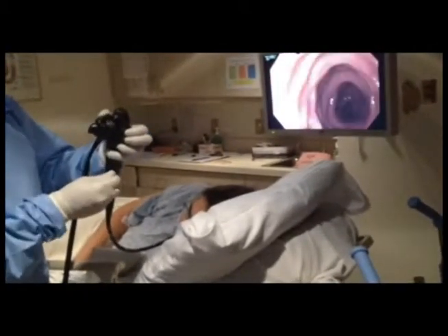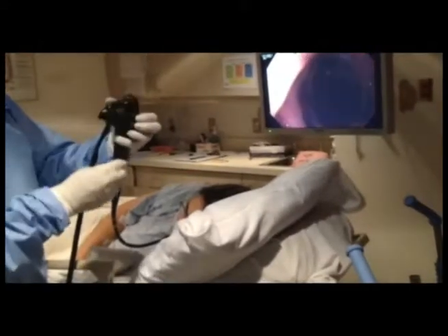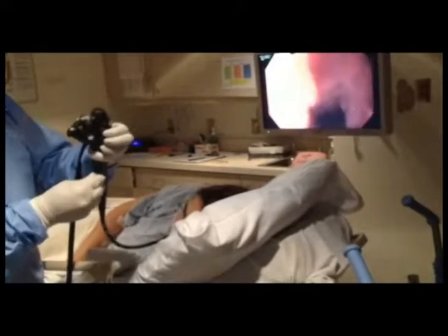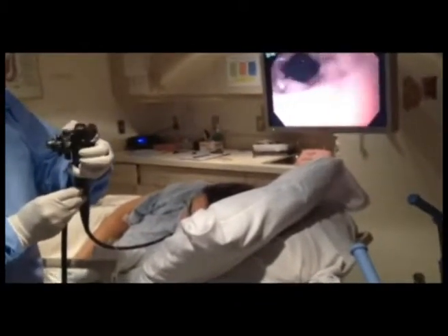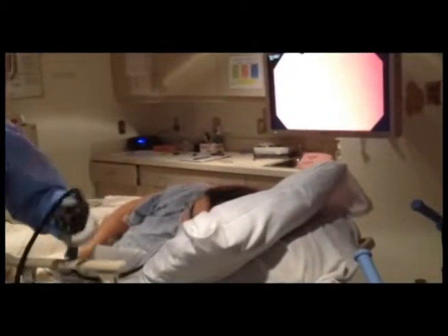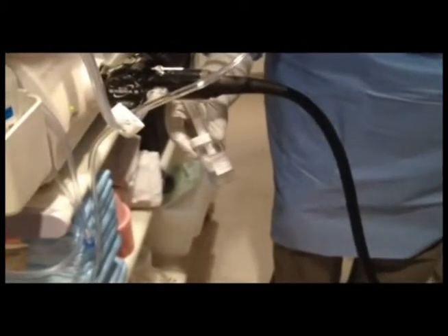Another trick I use is I'll actually lightly attach the port for aspirating and won't completely seal it. That allows me to not suction up the mucosa as much, so I don't traumatize the mucosa and don't get a lot of blood contamination. You can see here we're not really traumatizing the mucosa at all. Looking at the trap right now, you've got about 30 to 40 cc's of fluid. This is pure pancreatic juice.